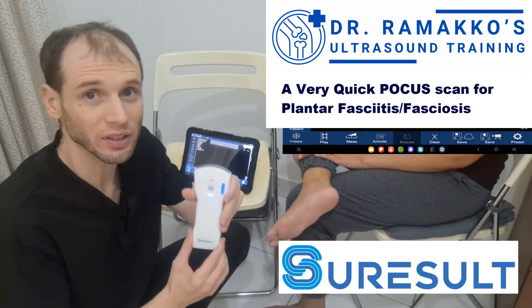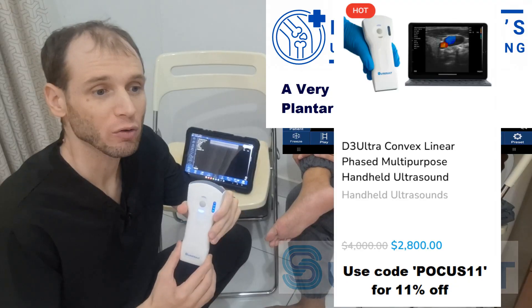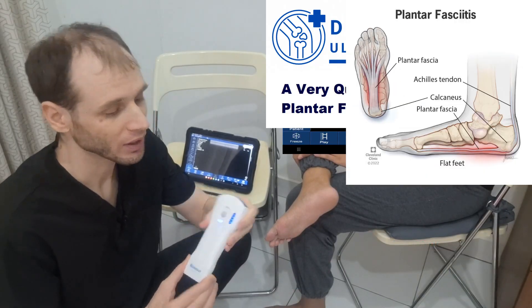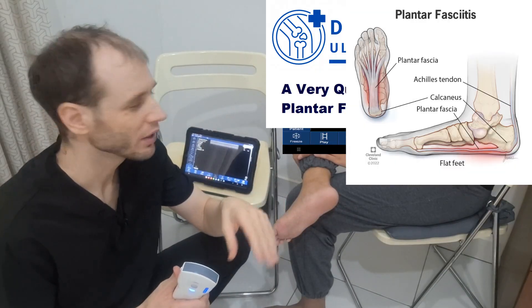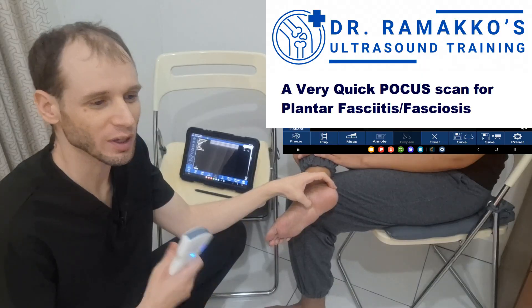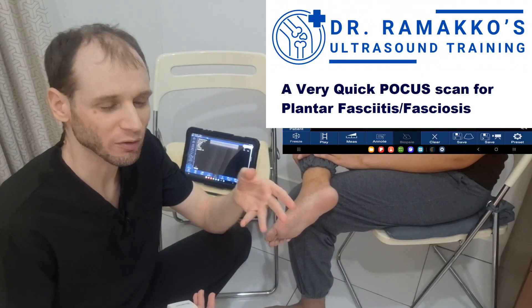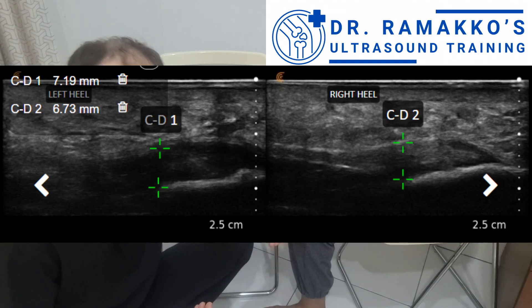Today we're going to use a SureResult D3 Ultra to evaluate the plantar fascia for plantar fasciitis or fasciosis. The evaluation is very simple. You look at the medial tubercle, which is typically where the patient says their pain is, and if the plantar fascia is larger than four millimeters, they have plantar fasciitis or fasciosis. If it's less than four millimeters, they're probably fine.